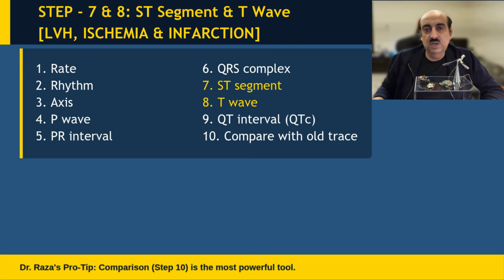So let's just quickly look at the ST segment and T wave together, because a lot of these pathologies are linked together.